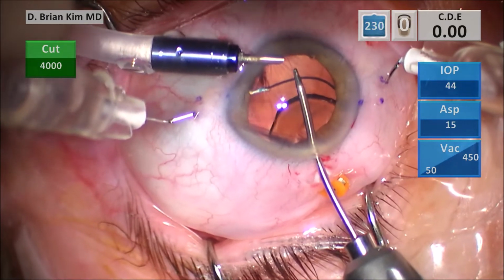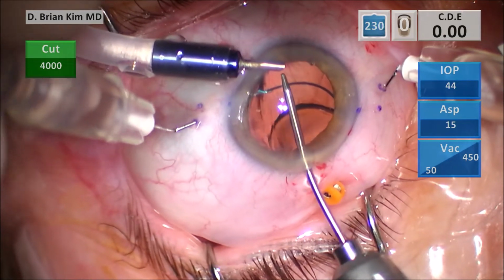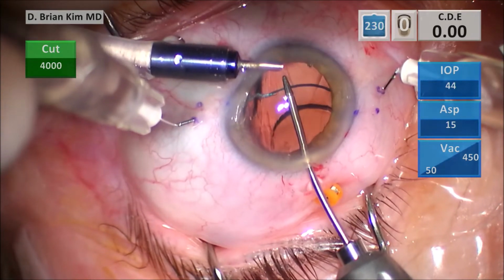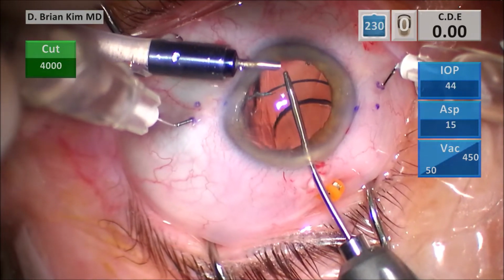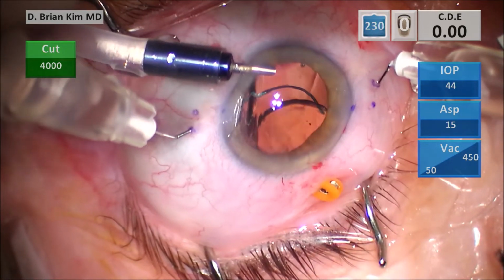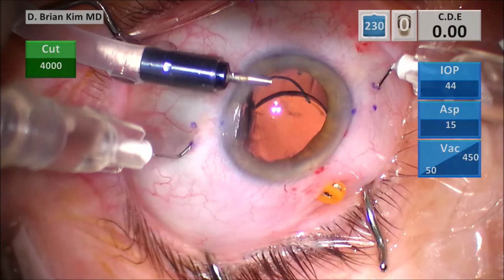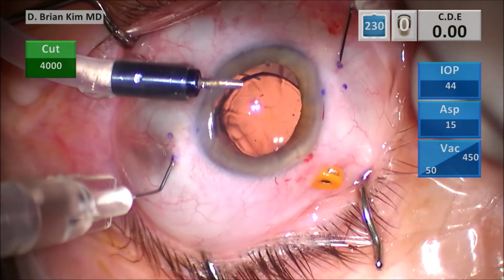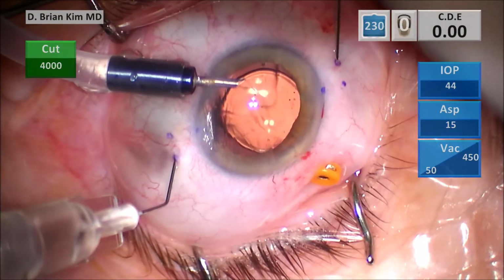Using microforceps to grab the leading haptic, docking the haptic on the bevel of the needle. Once you dock it, you can actually re-grab in some cases. You can see here, just go ahead and re-grab it, because once it's docked, it kind of catches the haptic so it doesn't fall as much. And I found that particularly true for this Sensor lens as opposed to some other lenses out there. So again, dock it, and then you can advance it.